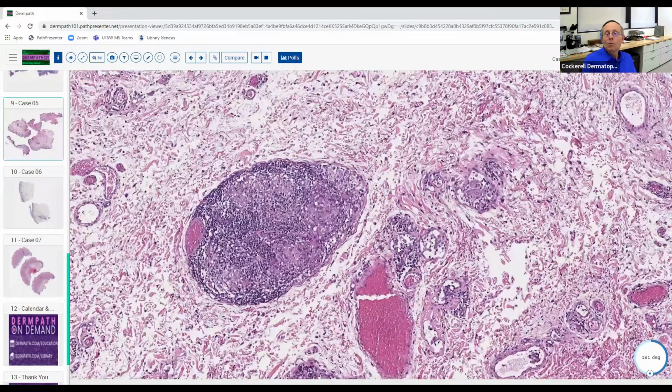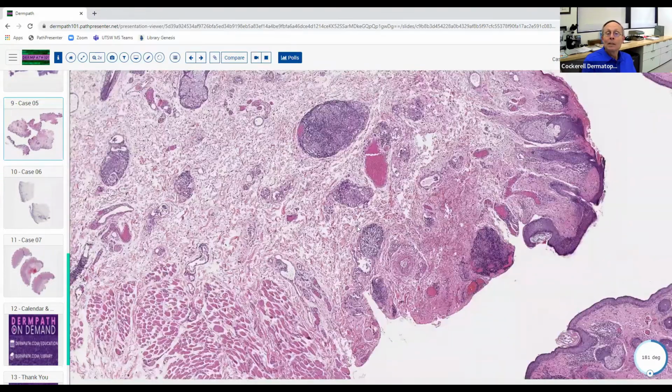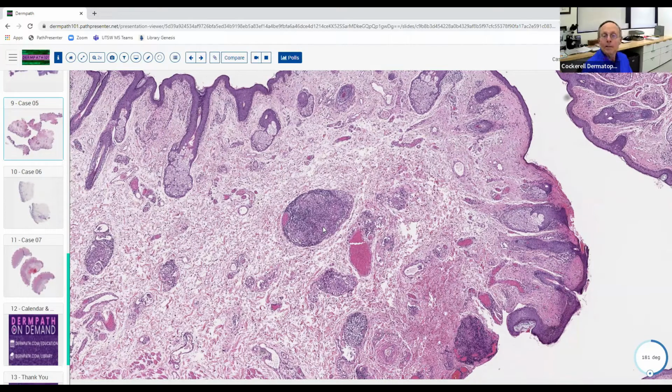Excellent. So once again, differential diagnosis goes down significantly, right, when we have that pattern. So let's say we're near mucous membrane. Maybe we're on the mouth. We've got sarcoidal granulomatous inflammation here. So what's our differential diagnosis? Is there like the cheilitis granulomatosis? Yes, good. That's one of them. Now, what all falls in that spectrum of cheilitis granulomatosis?